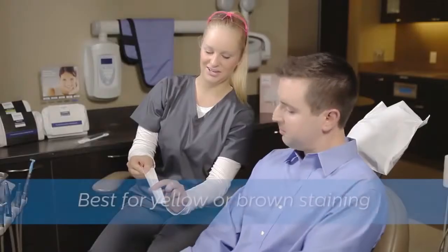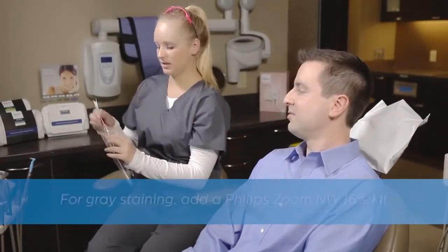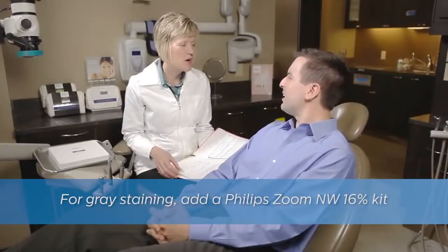Quick Pro is recommended for those patients with yellow or brown staining — they will see the most dramatic change. For patients with gray or tetracycline staining, Philips Zoom recommends using our take-home whitening with a Quick Pro session.